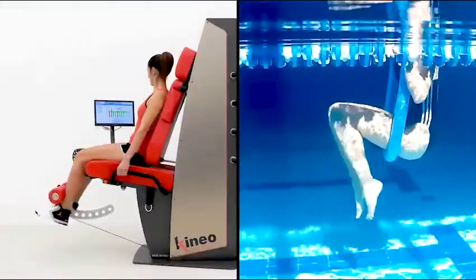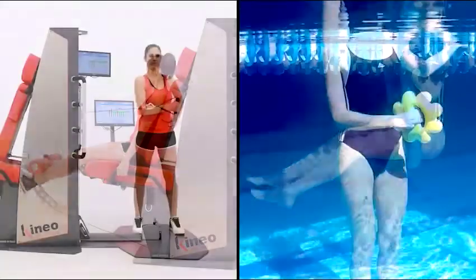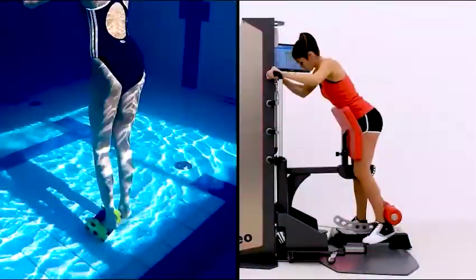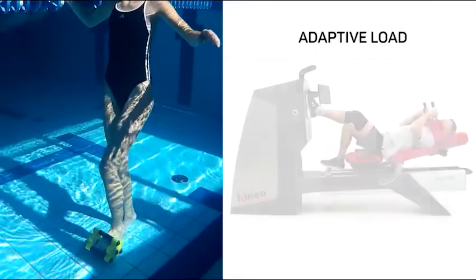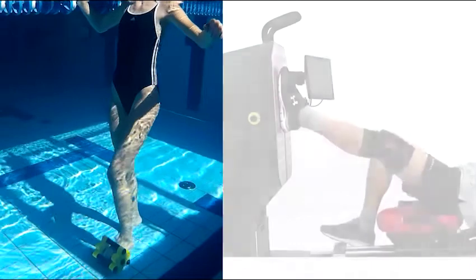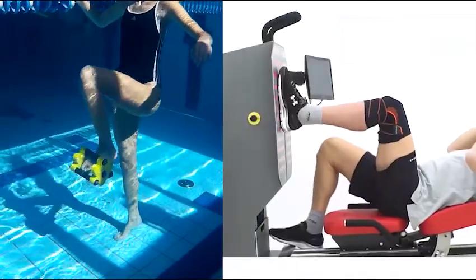With the Smart Viscous Method, the load changes in a smart way at every point of the movement, depending on the subject's capability. Just like in a movement inside a fluid, for example in water, the load is low for slow movements and high for fast movements.